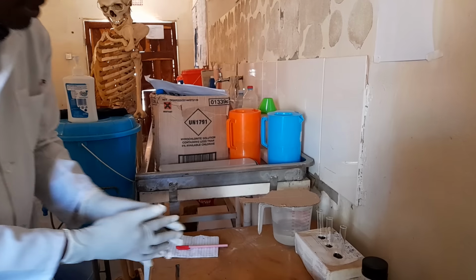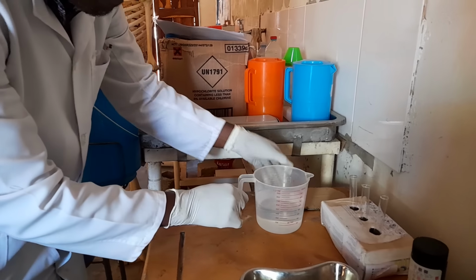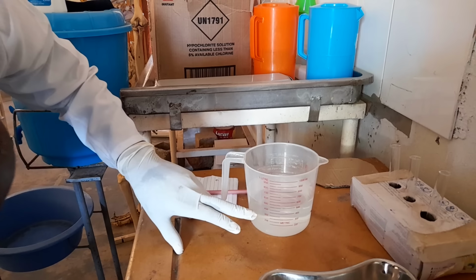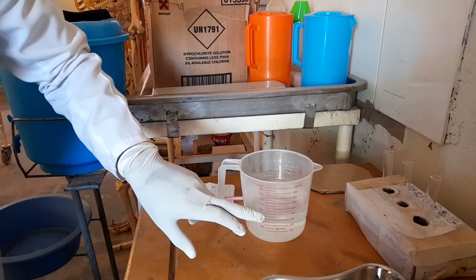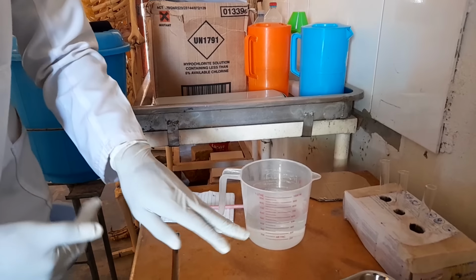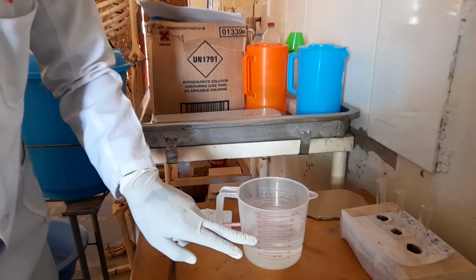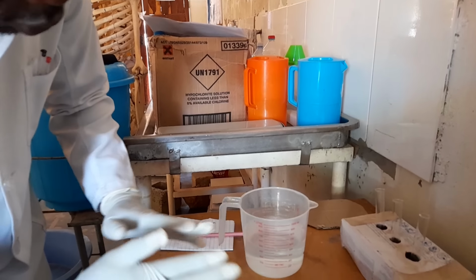Now let's see. We start with the physical properties. Under physical properties, you're going to get this urine and start with the amount. At this moment, this is 550, this is 450, so that line is indicating 500. You should master it in your mind that it's 500. But since you're doing an exam, you should tell the examiner that the amount of urine is 500 mils, so that you have a mark on that.